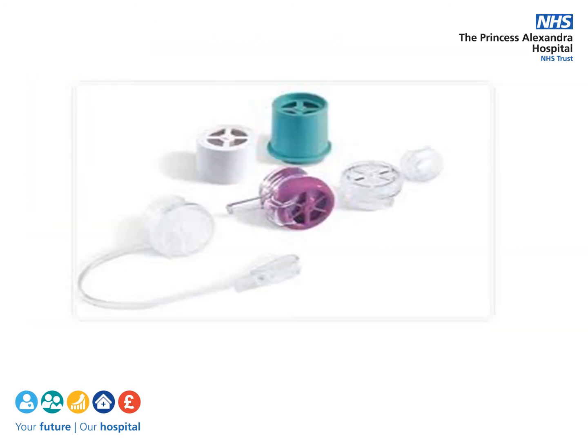And here's an example of the speaking valves that we use. They all look a little bit different to each other, but they all effectively do the same thing.